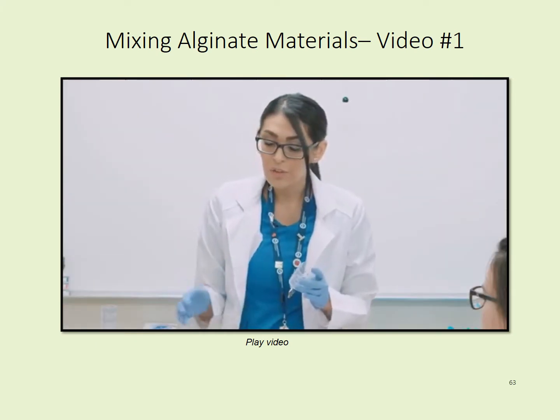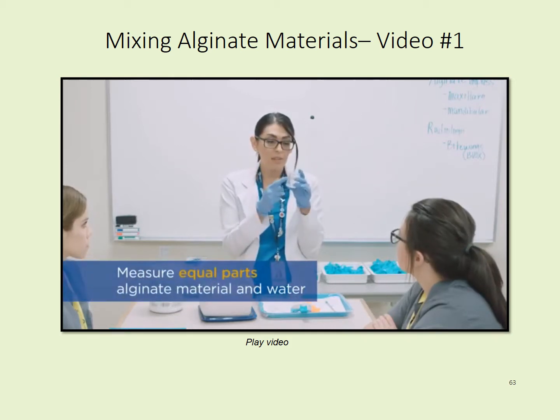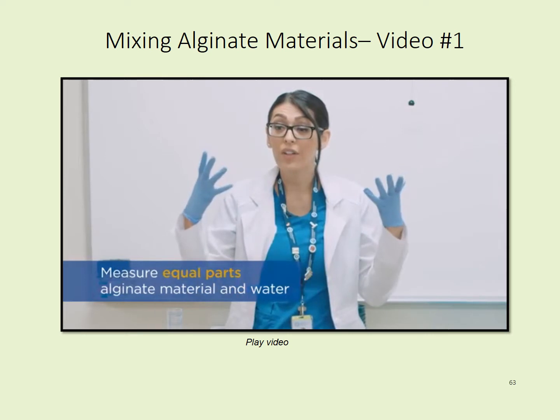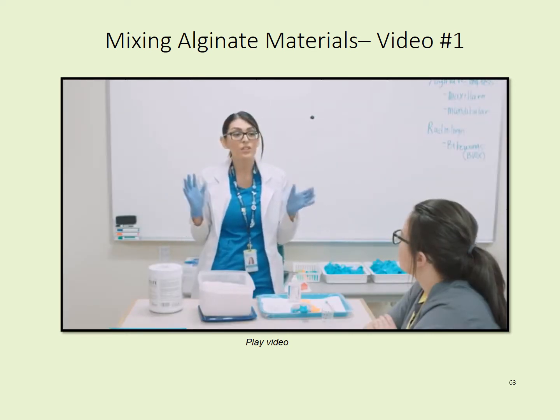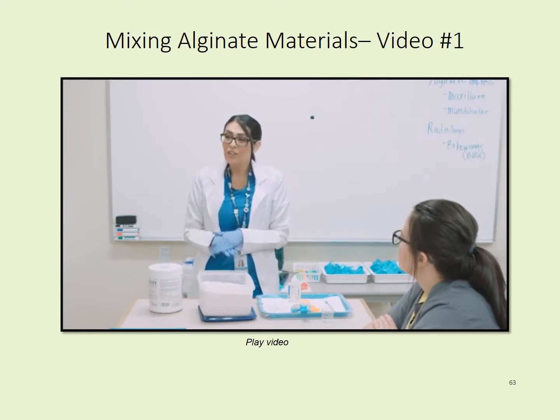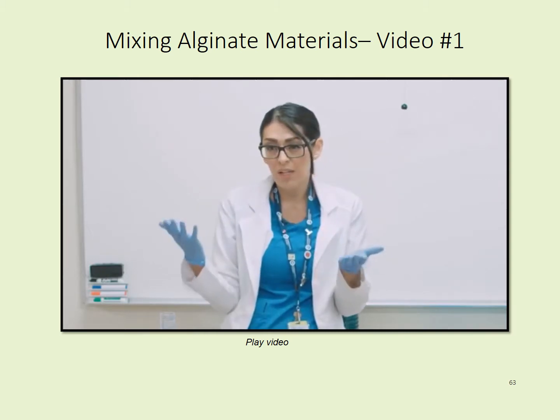Now, if we were to do 2 scoops of alginate here, we would need 2 measurements of water. If we have a patient who has a wider mouth and we need a large tray, we're going to want to use 2 or 3 scoops of alginate. If we have a child or someone with a very small mouth who needs a small tray, we can use 1 scoop of alginate.